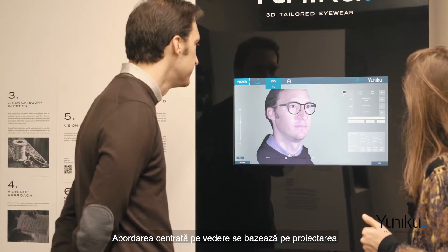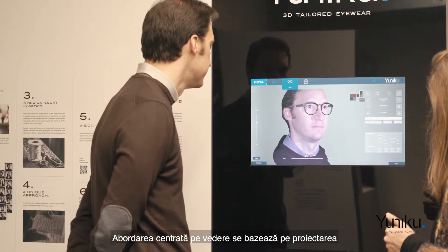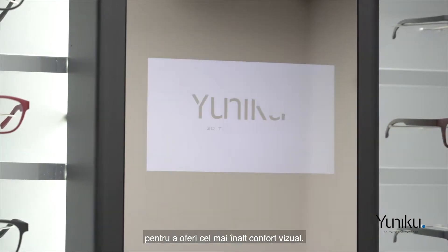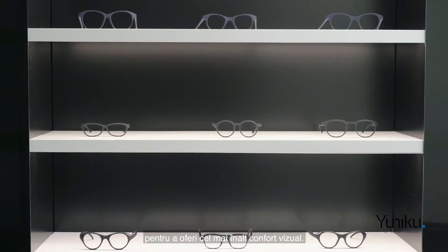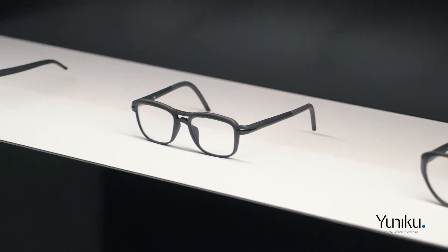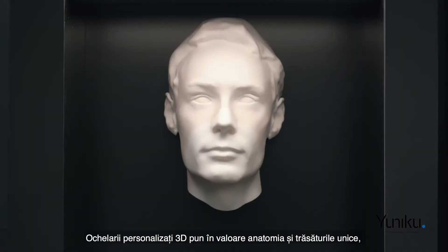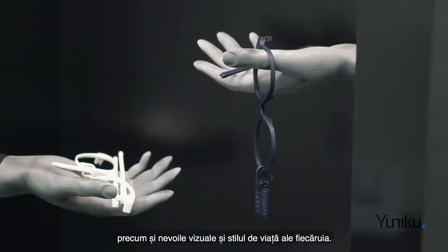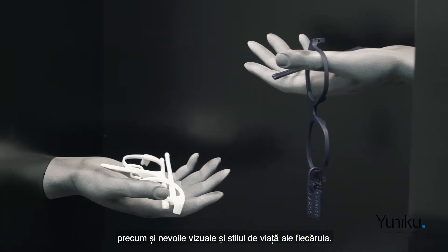A vision-centric approach considers designing and making the frame and the lenses at the same time in order to bring the best visual comfort. 3D Tailored Eyewear basically celebrates the unique features of an individual's anatomy, their visual needs, and their lifestyle.